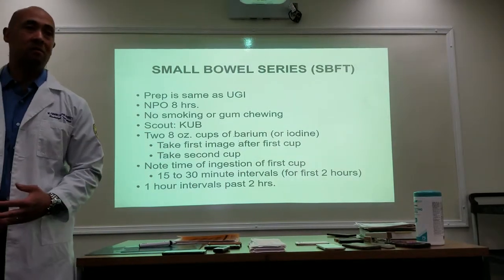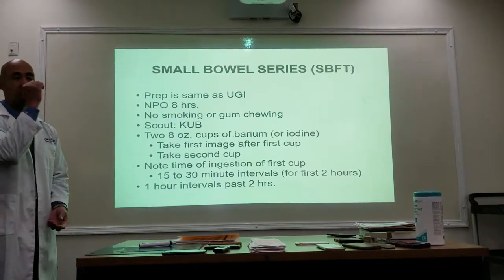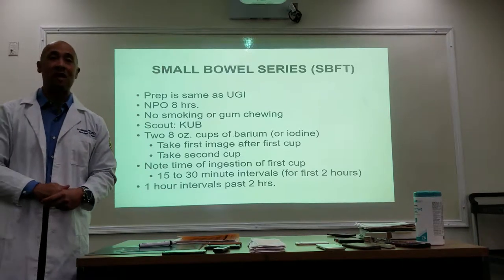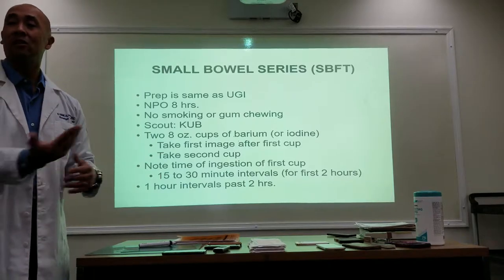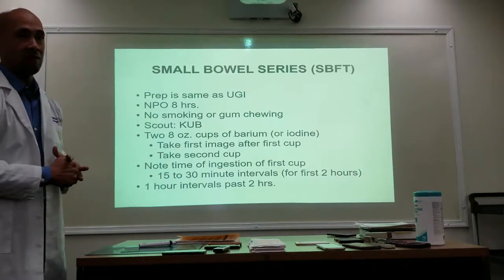Until it reaches what? Colon. The ileocecal valve, okay? So they just keep taking those x-rays until they see that ileocecal valve, and when the doctor feels like you're in that area, then he'll do the fluoroscopic procedure to focus on that valve.